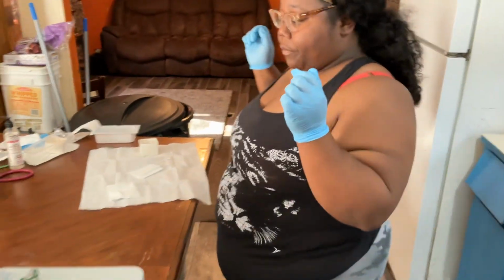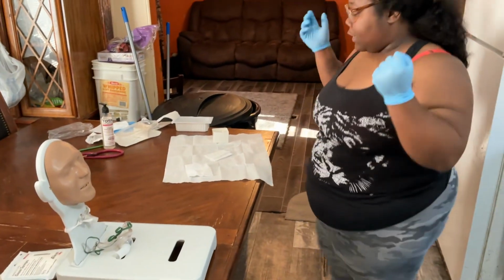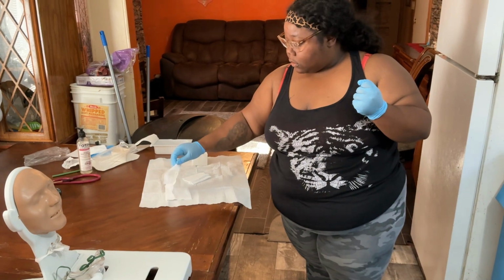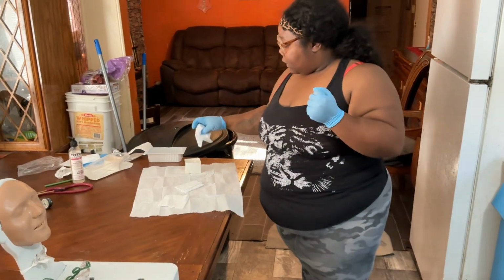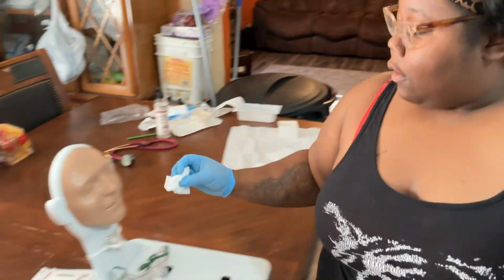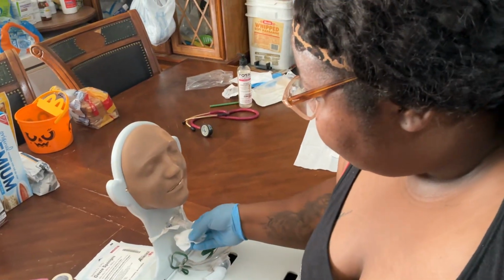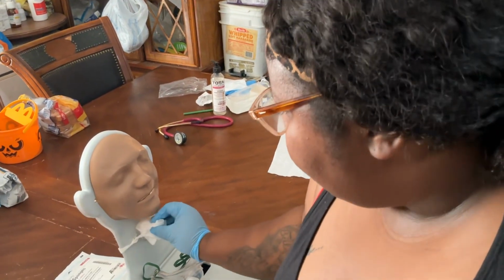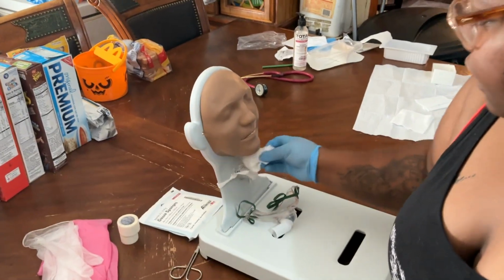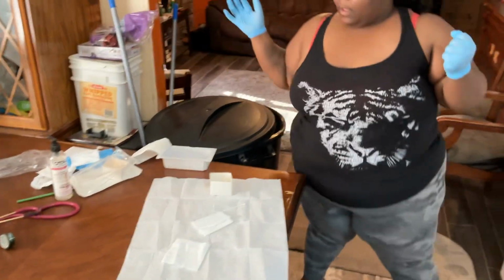Okay. Now what I'm going to do is go ahead. This is my dirty hand. This is my clean hand. I'm going to go ahead and get this gauze. I'm going to put it in the clean water. Come around. I'm going to clean around my stoma again to get any excess secretions off of my trach opening. Clean on all sides. Alright. Come around my sterile field. Gonna discard in the appropriate bin.